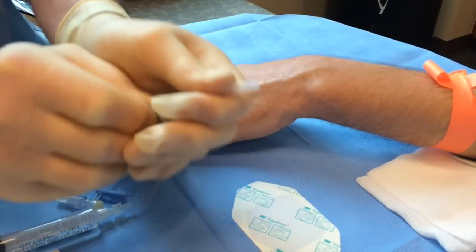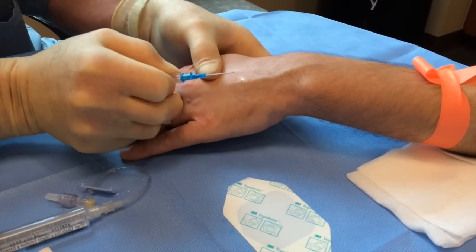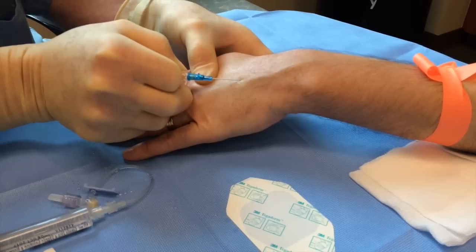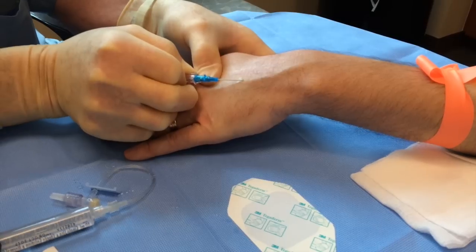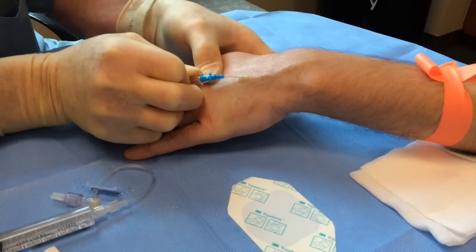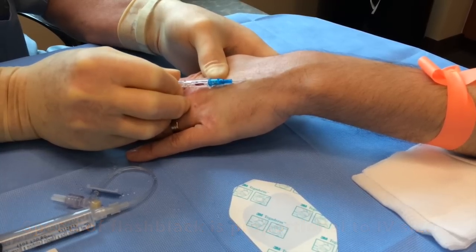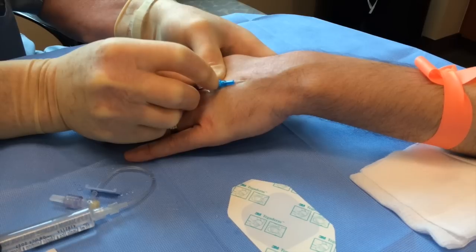I remove my needle guard. Once again, I retract the skin with my non-operative hand, and then I enter the wheal slowly and carefully and line up with the vessel. When I enter the vessel, there's a nice flashback. Continue counter traction, and with your operative hand, you just advance the cannula.